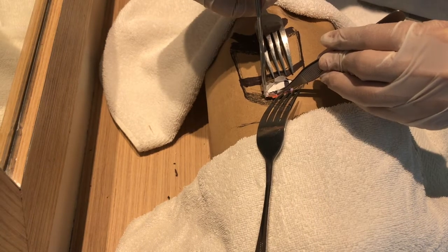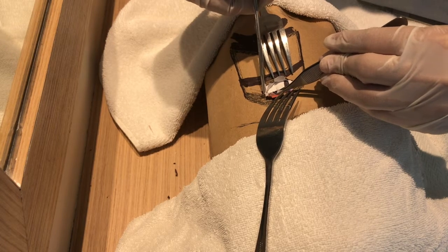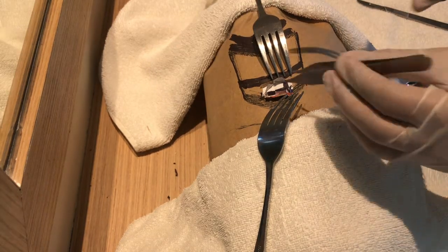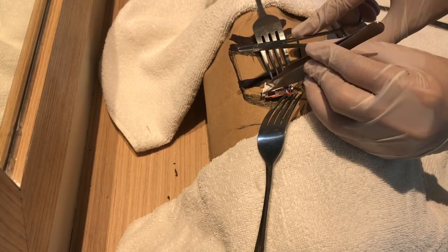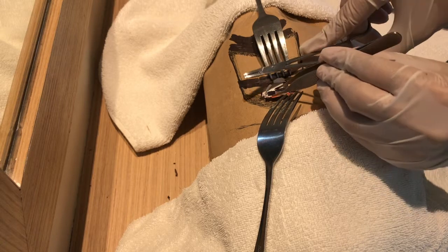Next is to create an inferiorly based flap raised from the anterior wall of the third and fourth tracheal rings. Then, a silk traction suture is passed through the flap and is loosely secured to the skin.